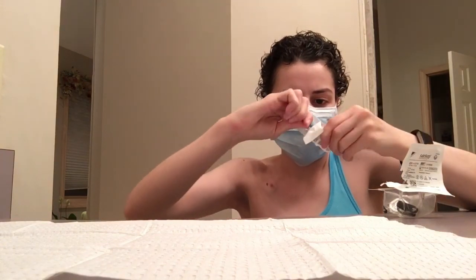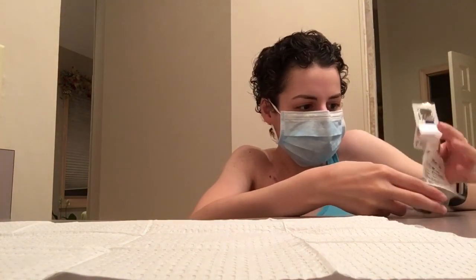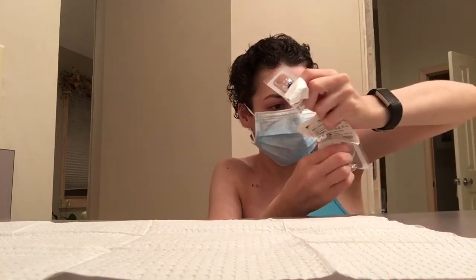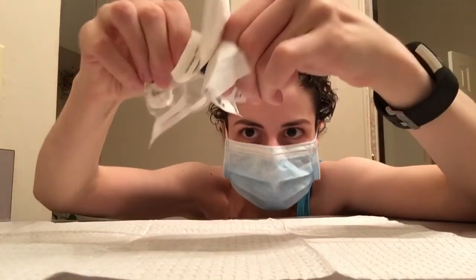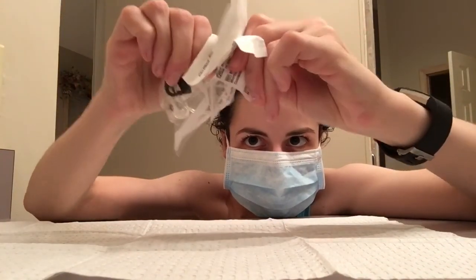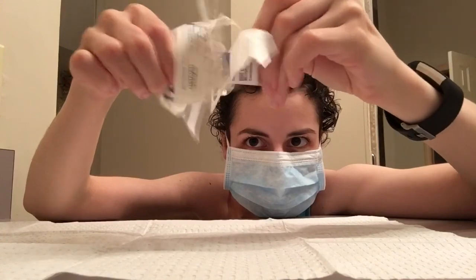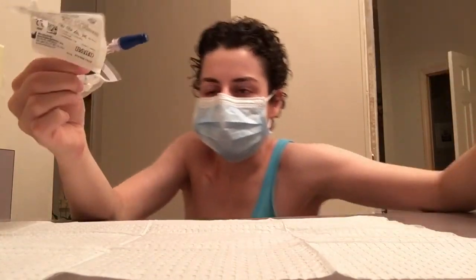So now I'm just touching this part of the blue cap and not the part that's connecting to it. And I'm gonna roll this back like that. And now you just pair them up and make sure they're not touching anything but themselves. I'll go like this. You can't really see it yet. Making sure it's really on. But see, I'm just gonna pull that out, and now this is sterile.